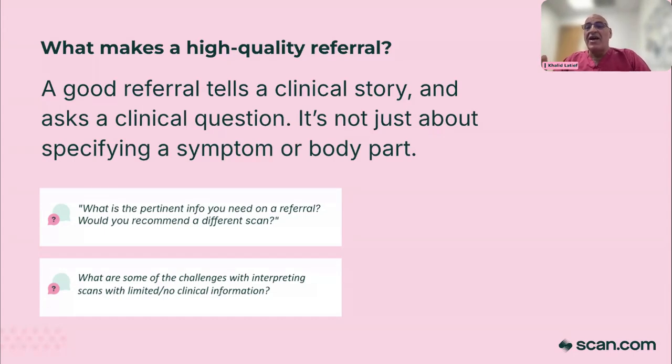So it's really important. And if they've got pain in the knee, tell me where it is. Is it in the front? Is it in the back? Is it on the lateral side? Is it on the medial side? Because we've got this whole set of images, and we've got lots of findings on them. And then we've got to make a decision as to which of those findings are important for the clinician. So I always say to the clinicians, if you want a good report, give me good clinical information and what you want from the scan. What's the clinical question? What's the question you want answering? And that's what makes a very good referral.